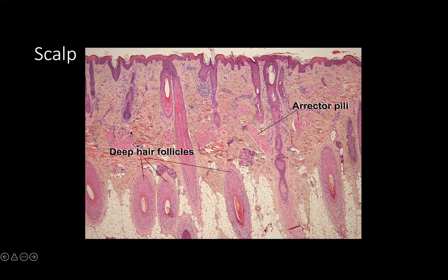And I want you to keep in mind when you're counting hair follicles, if you just see one hair follicle in a plane of section, you're going to count that as one because they're going in and out of the plane of section. So every little hair follicle you see represents one hair follicle more often than not, because the hair follicle is not going to cross back and forth into the same plane of section. It's either going to go in and out in one level, or you're not going to see it at all. So just keep that in mind. So here we've actually got 1, 2, 3, 4, 5, 6, 7, 8, 9, 10, 11, 12, 13, 14 follicles in this one section here.